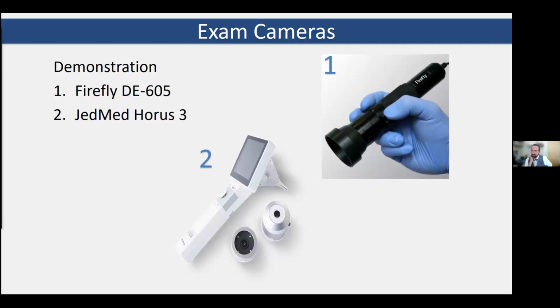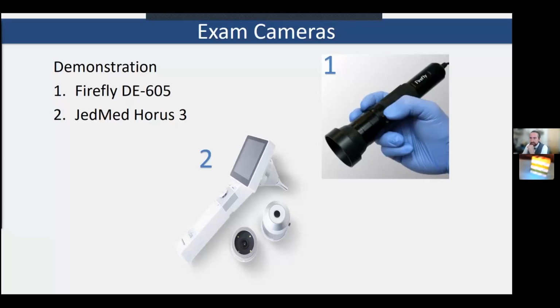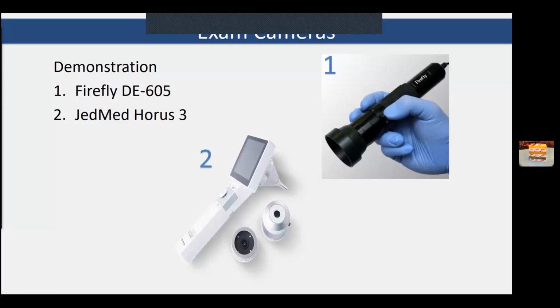And we're going to show you what this image looks like. So first off, we're going to take a look at our little focus object here. Usually I dial in the focus from the device. Go ahead and pin this so I can see it a little bit better. So as I adjust the slider, we can see as that image comes into focus. You can also see as I adjust the brightness from the built-in LED, and that's off.